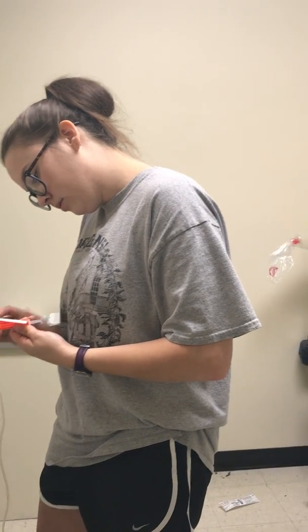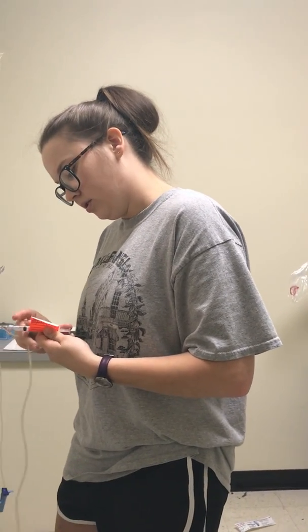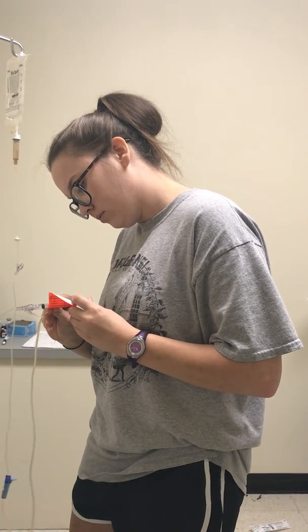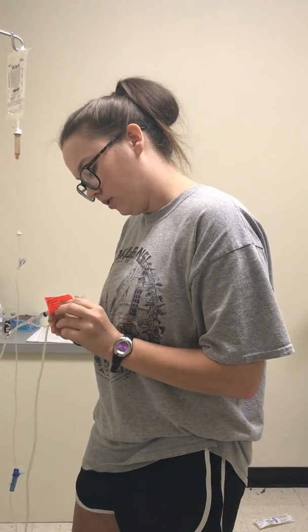Okay, gonna apply the next milliliter. Kinking the tubing. I'll release it.